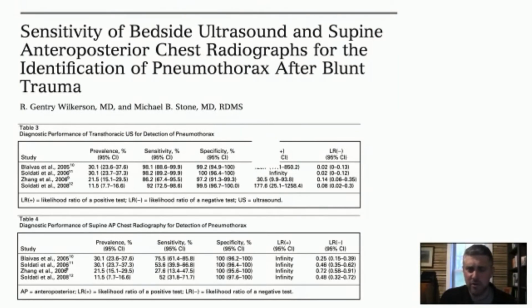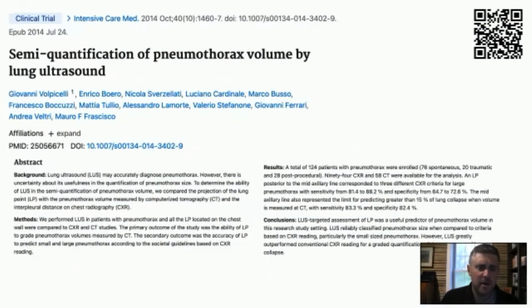It could be as low as a coin flip, right? Now the further question, because we're all about taking our ultrasound to the next level, right? You do the textbook style ultrasound, but we want to take it to the next level to be the best that we can be, and provide the best service we can for our patients.